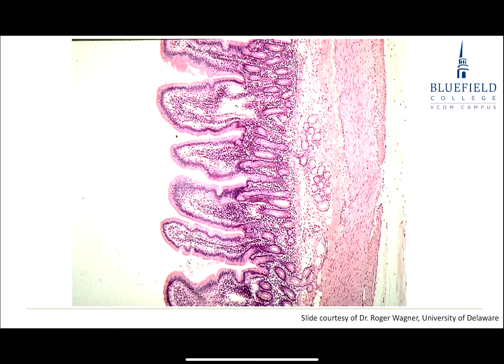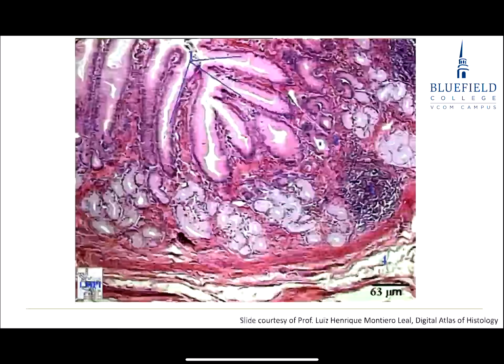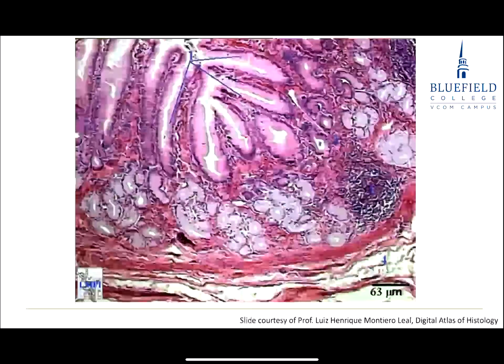Okay, here's the stomach right here. You don't have to recognize it per se, but you look over here, this is normal in terms of the connective tissue among the glands. And I've got over here, boy, that's probably nodular lymphatic tissue without a germinal center, isn't it? Okay, question? It's probably more macrophages in there than normal, a higher concentration of macrophages. You haven't recruited enough T cells and B cells yet. Okay?